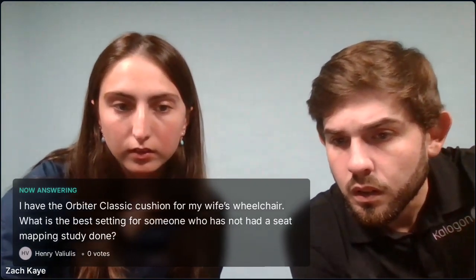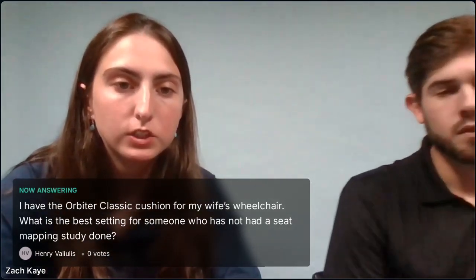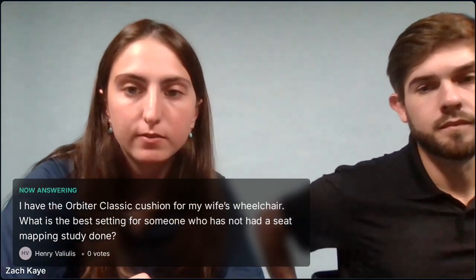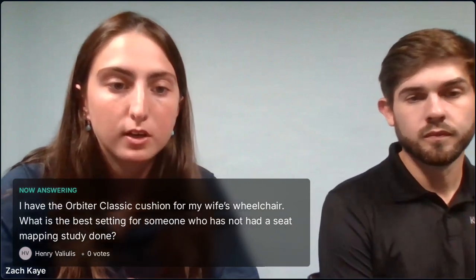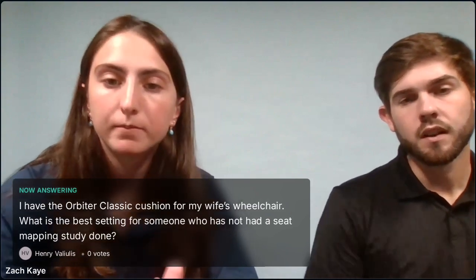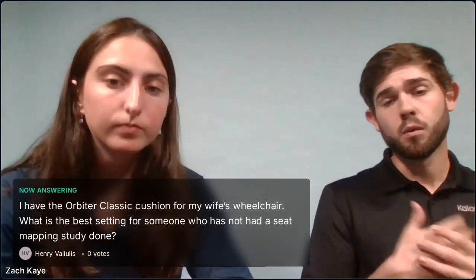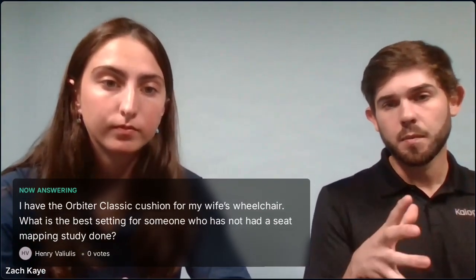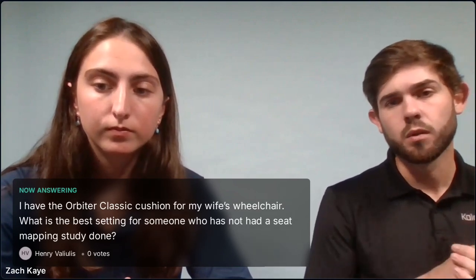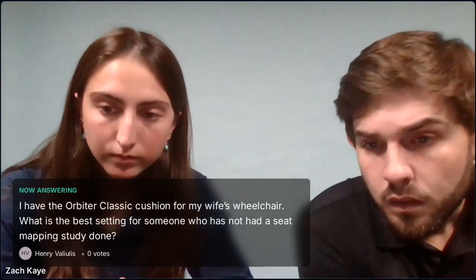So for Henry, where are you located? Because I could reach out to one of our independent reps, and also the ATP that you currently work with, to see if there's a way for your wife to get pressure mapped on her current Orbiter Med or Orbiter Classic. Sorry. We have done a lot of different pressure mapping studies in general, where those default settings we send out with the cushion will work for a wide variety of people, but it won't be dialed in specifically to your wife's body type. So that's where we really recommend pressure mapping. If you had a facility or a therapist you were working with that had a pressure map, it would be really beneficial, I believe.